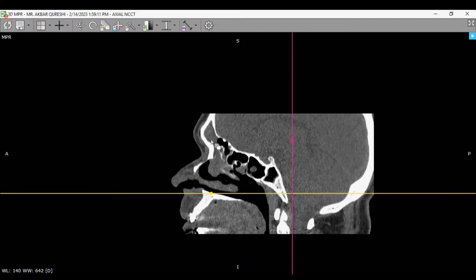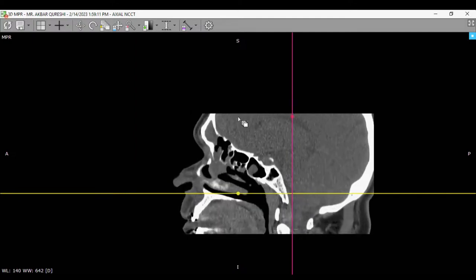Had there been a frontal cell, it would have been attached like this, and then you would have to go behind that. Here this cell, see this pneumatized cell attached behind, and this outflow is narrowed anterior to it. Here you cannot afford to go behind that cell, and you have to open up this cell and flush it. I hope it is very clear.